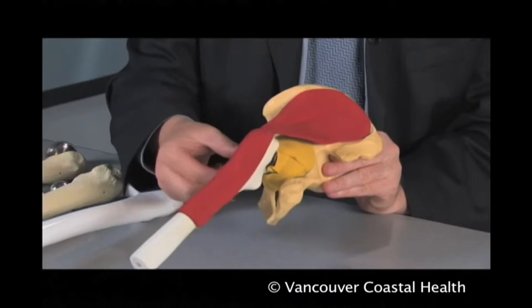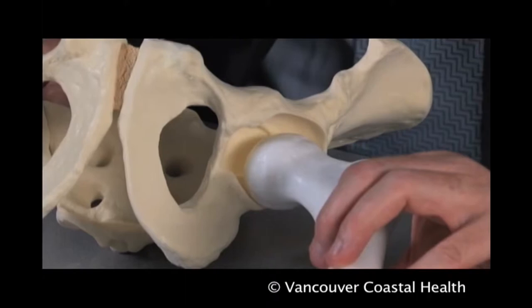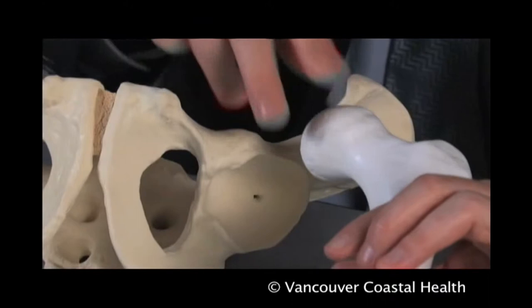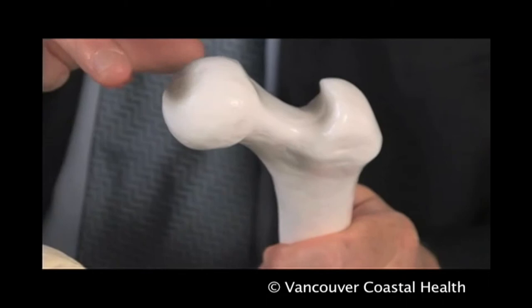The other common surgical approach involves pushing the gluteus medius abductor muscle anteriorly and incising the capsule posteriorly — this is called the posterior approach. In order to adequately treat advanced destructive arthritis of the hip, we have to replace or resurface the femoral head portion, or the ball of the joint, as well as the acetabulum, or the socket of the joint.